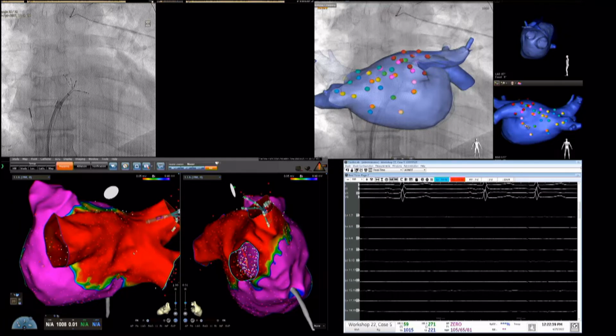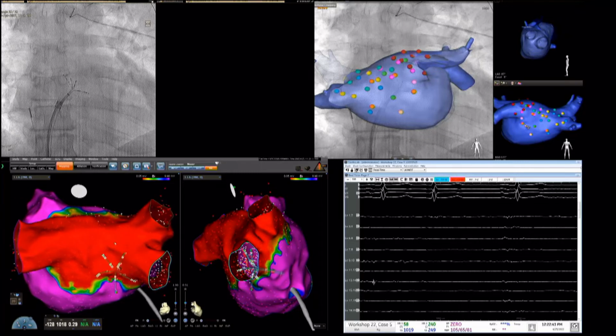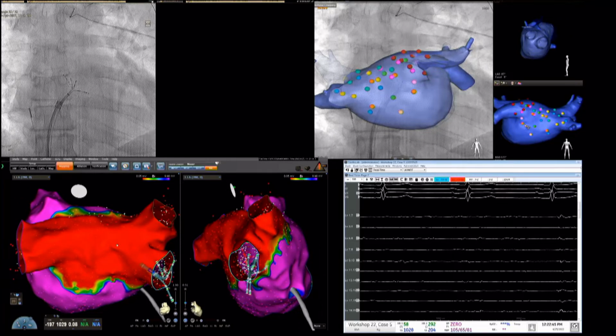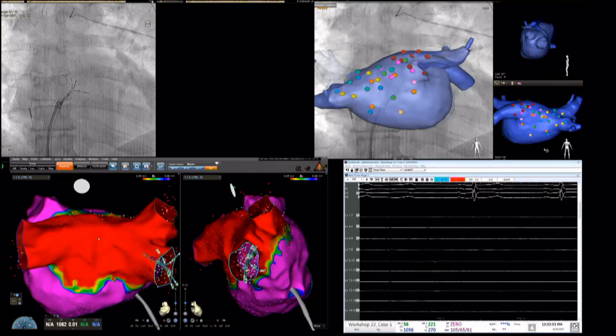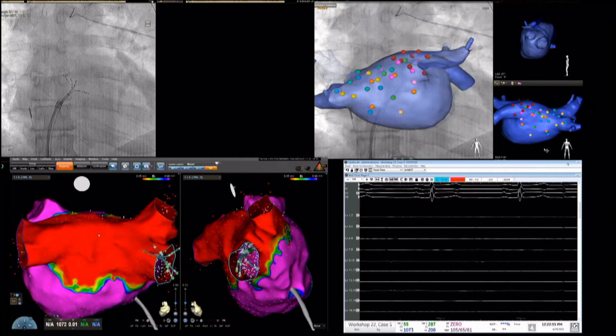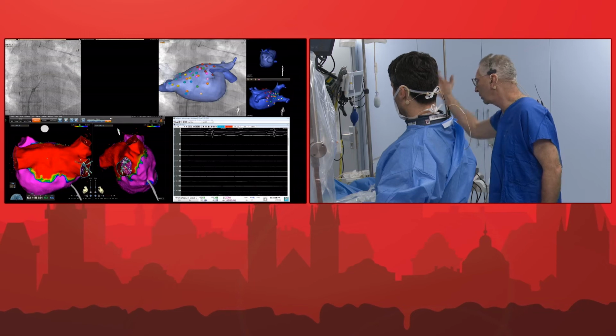And actually, can we show them the improved tagging on the CT, because we changed the tagging, and it was done properly right now, okay? So this is really like what we do in the usual case, okay? So can you move right and left to give them an idea? Perfect, okay? Go tilt it down.